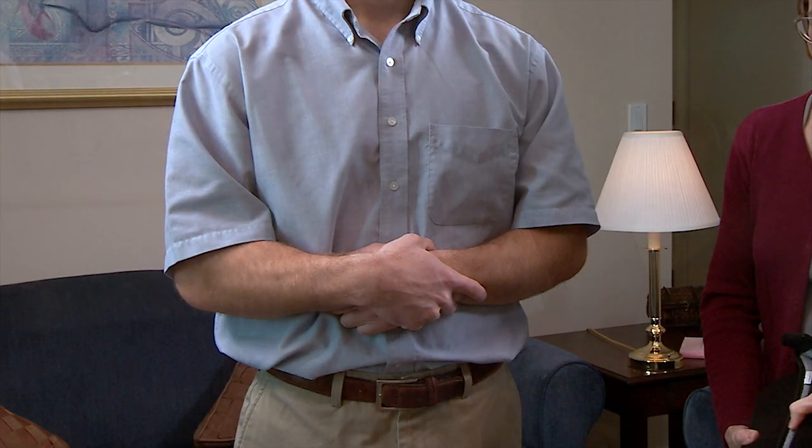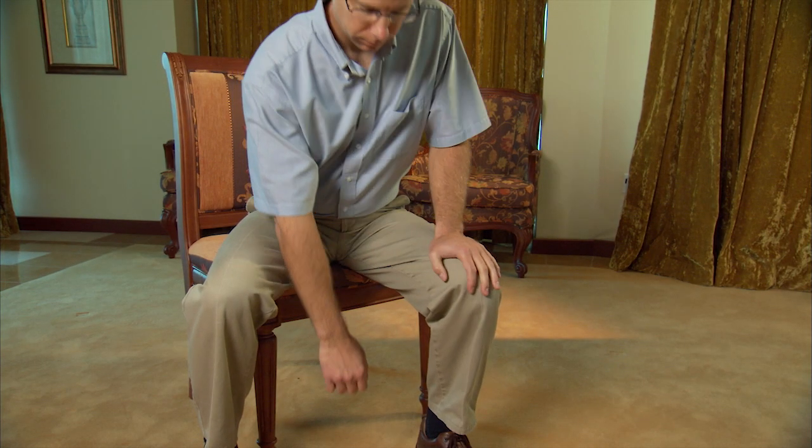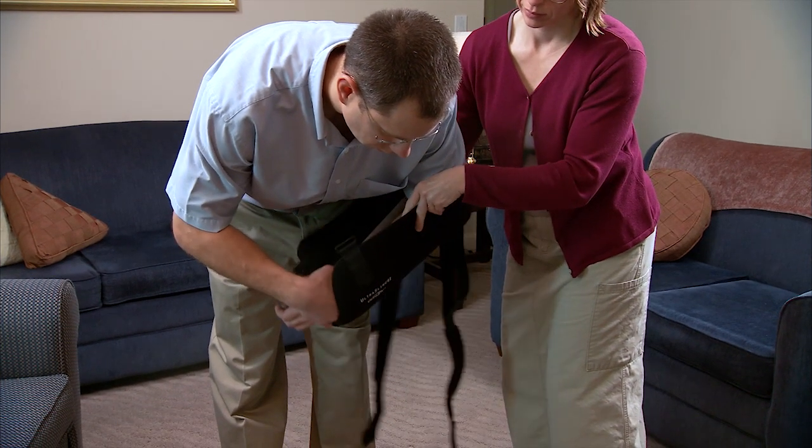Now we'll demonstrate how to put on the sling. Sit or stand, holding your healing arm against your body. Bend forward, lowering your arm and letting it dangle. If you are sitting, dangle your arm between your legs. Do not dangle your arm to the side. Your helper places the sling around your arm.